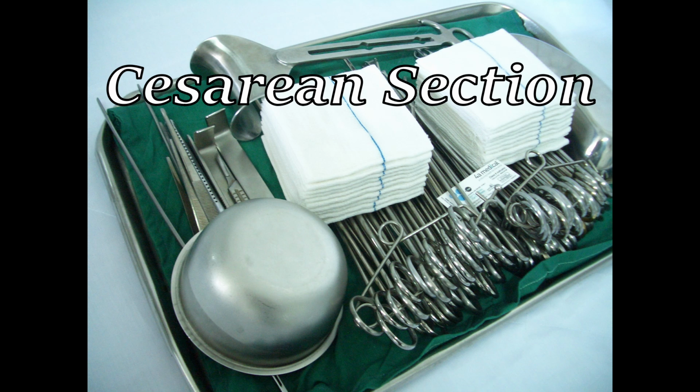Step 3. Uterine exposure and incision. The uterus is exposed by placing a bladder blade retractor inferiorly and using Deaver or Richardson retractors laterally. The bladder flap is created by dissecting the peritoneum off the lower uterine segment, using blunt dissection or Metzenbaum scissors, then pushing the bladder inferiorly.